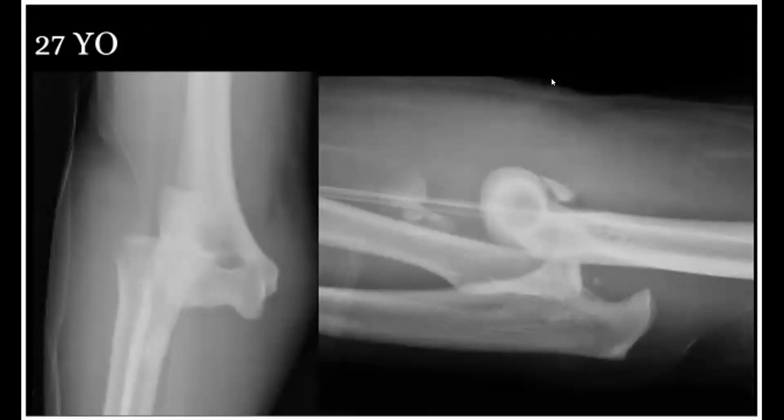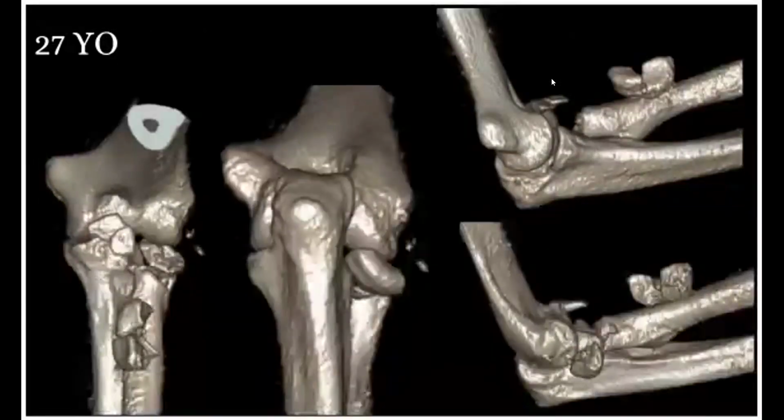I like to look at the initial radiographs, seeing the severity of the initial injury. We see how this humerus has been shunted down the forearm, how the radial head is halfway down the proximal radius. We see a terrible triad with a significant coronoid injury. It's not the usual intermediate ridge piece, which would be the Wrightington B+, the bifacet coronoid. This injury has injured the medial collateral ligament, common flexor origin, common extensor origin.